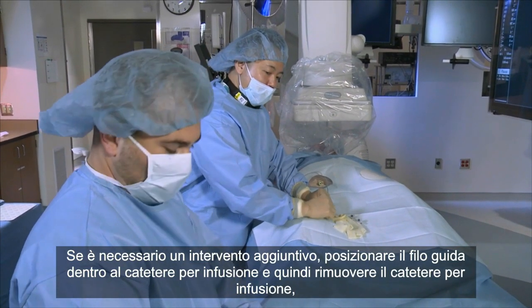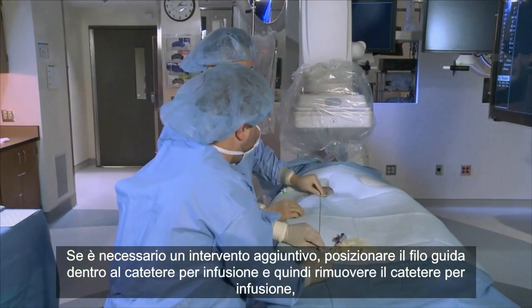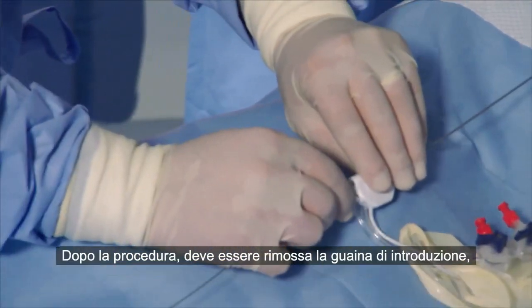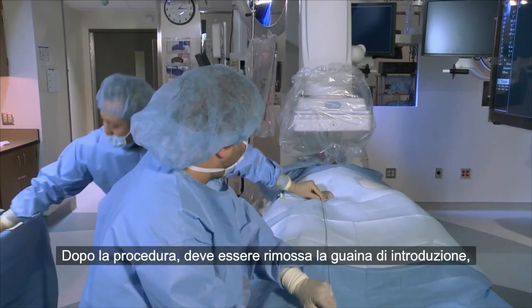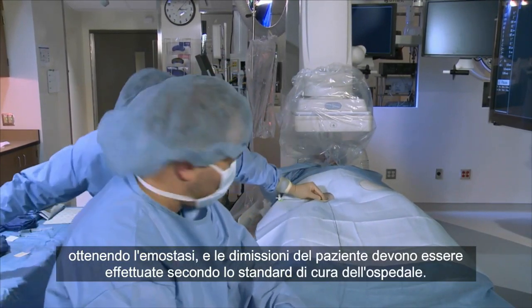If additional intervention is required, place the guide wire through the infusion catheter and then remove the infusion catheter, leaving the guide wire in place to facilitate placement of interventional devices. Following the procedure, removal of the introducer sheath, attaining hemostasis and patient discharge should be performed per hospital standard of care.